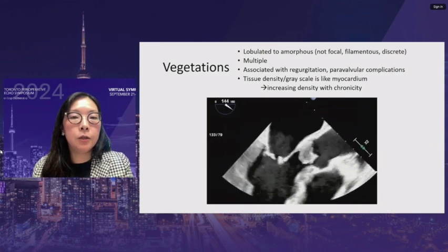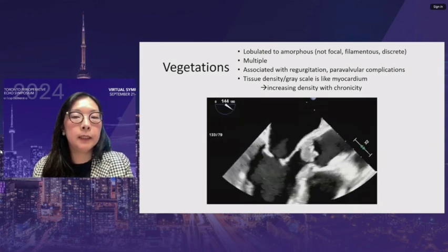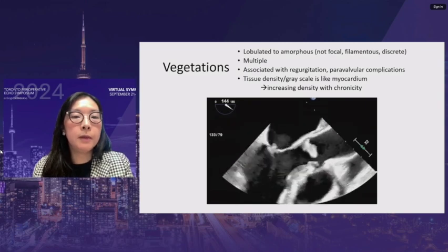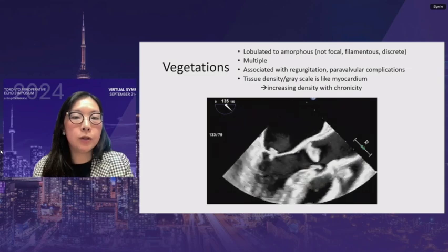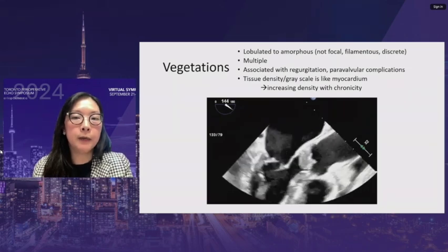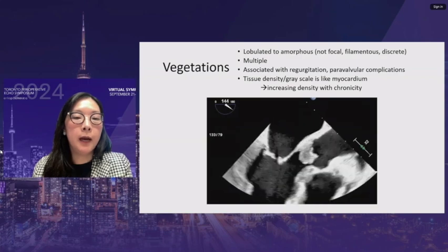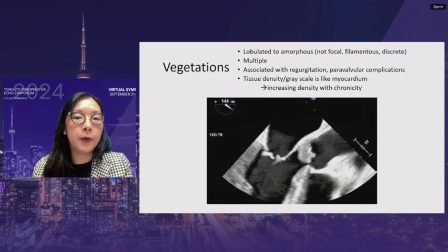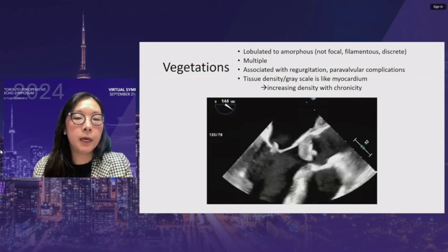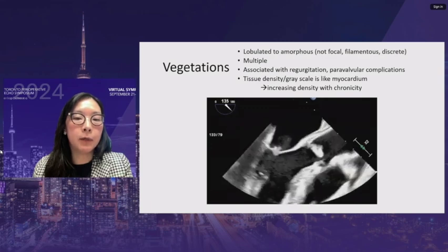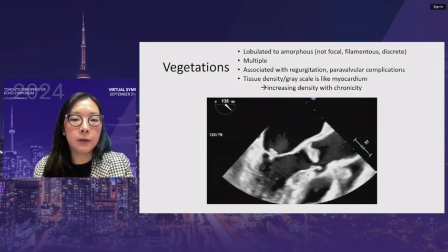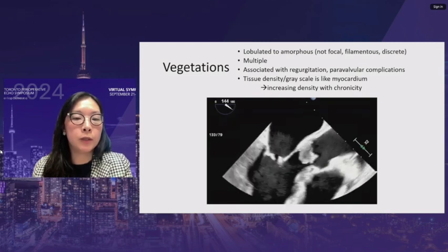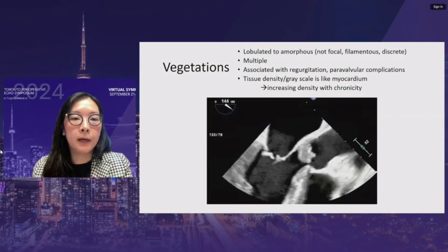Vegetations tend to be lobulated and amorphous — not focal, filamentous, or linear. They can be multiple and are usually associated with regurgitation or paravalvular complications. Tissue density on grayscale is usually similar to myocardium, but with increasing chronicity, healed vegetations become more dense. A transesophageal image shows a large vegetation on the aortic valve and two smaller ones on both the anterior and posterior mitral valve leaflets.